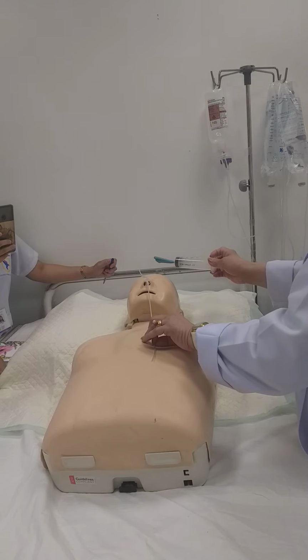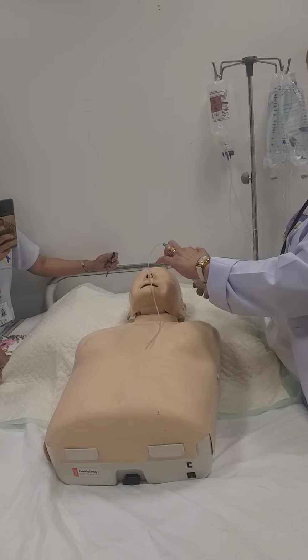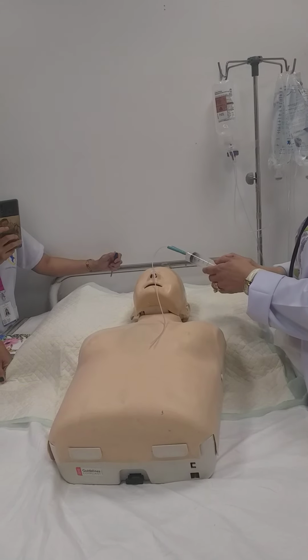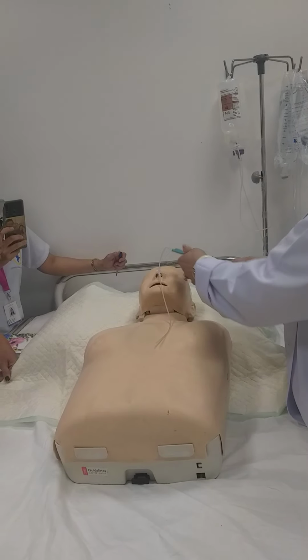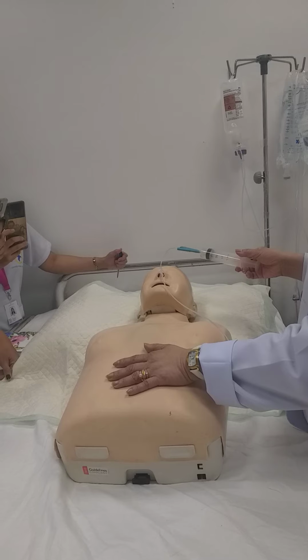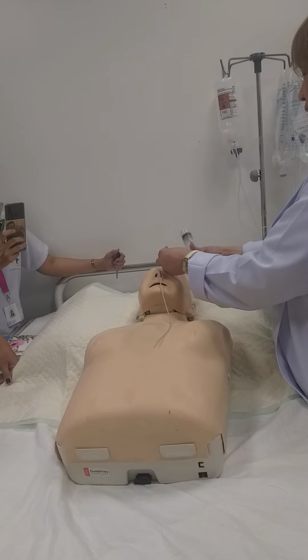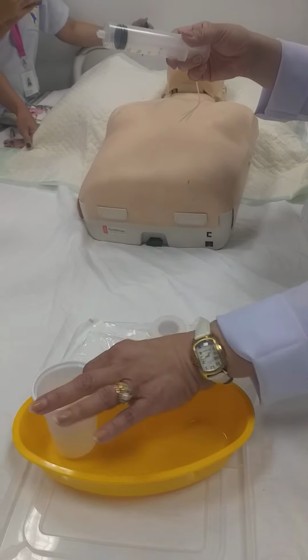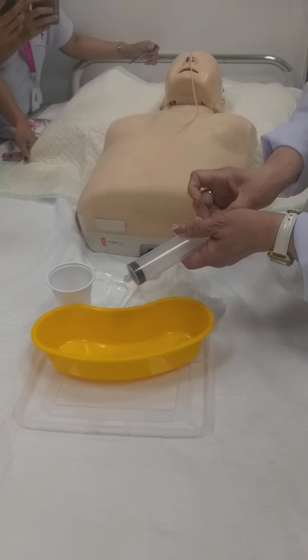Okay. Second test. Aspirate 10 ml. You have to aspirate either whitish or yellowish gastric fluid. Once you see a gastric fluid of whitish and yellowish, it means you are in the stomach. Okay, so test two. So pinch, close. Close it. And your 10 ml, dispose it to the receptacle. Remove it.